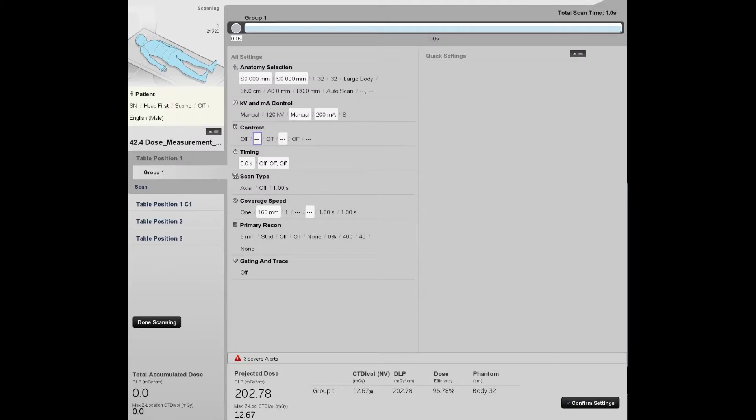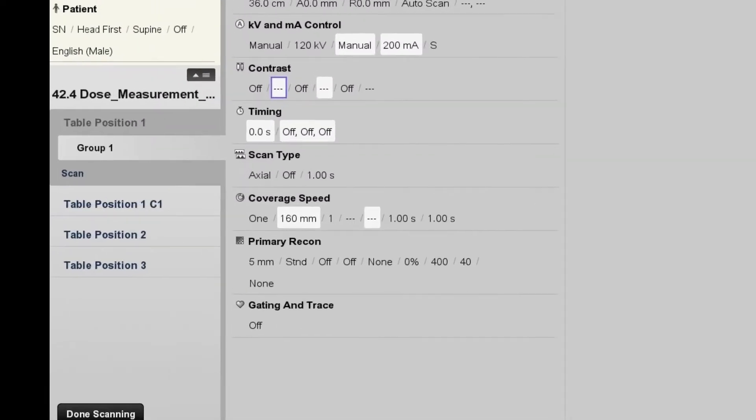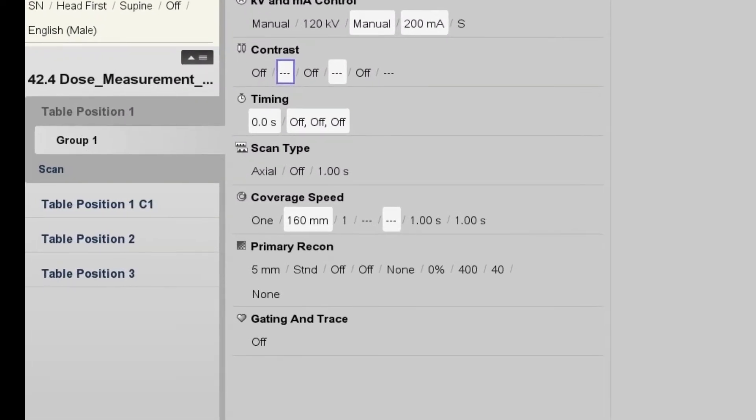In this example, we set the scanner up for an exposure with a 1 second tube rotation time and a collimation of 160 mm.